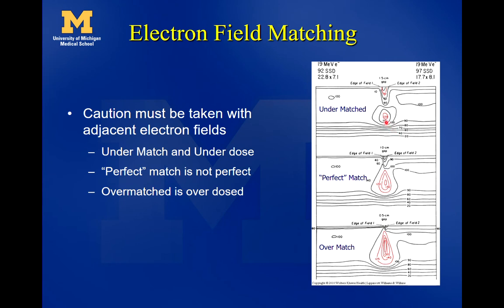And you can see the dose deep inside the patient is 120 because these two beams bow in towards each other, and the dose at depth sums up and contributes, one beam contributes to the other.